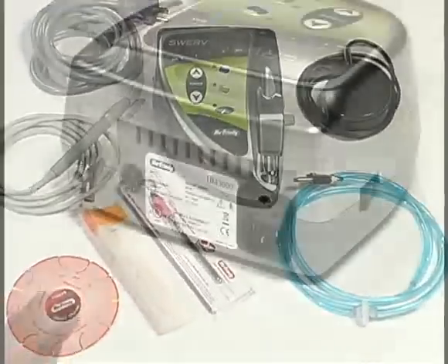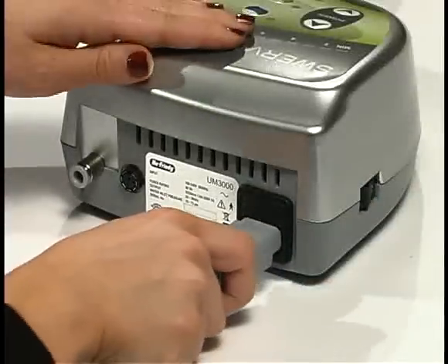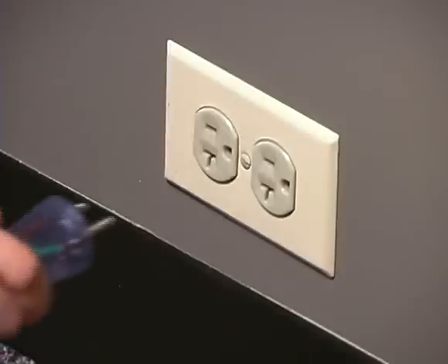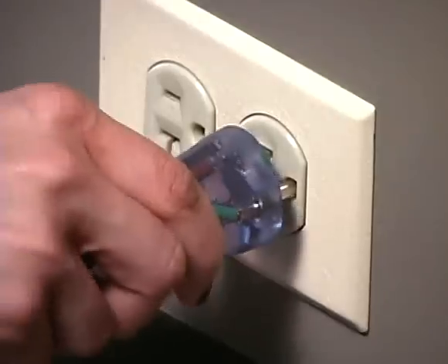Unpack the device. Insert the power cord into the inlet at the back of the control unit. Plug the power cord into the power receptacle or wall outlet.